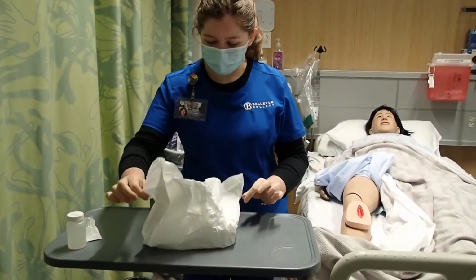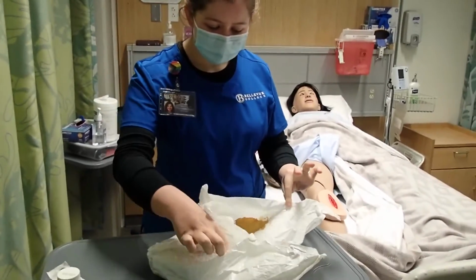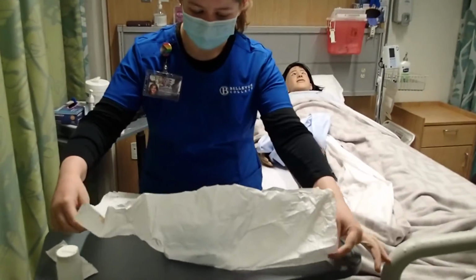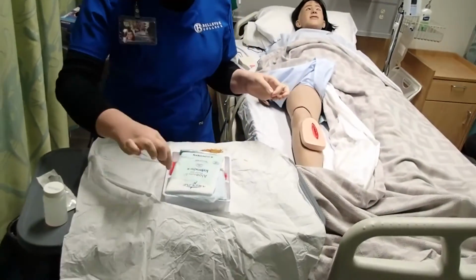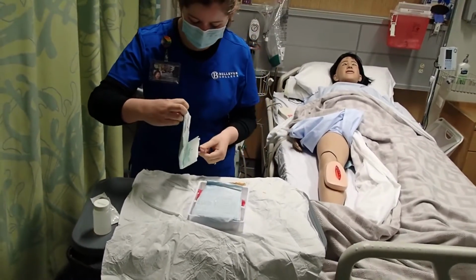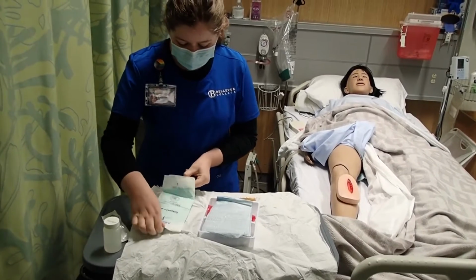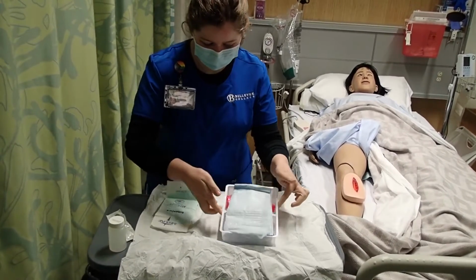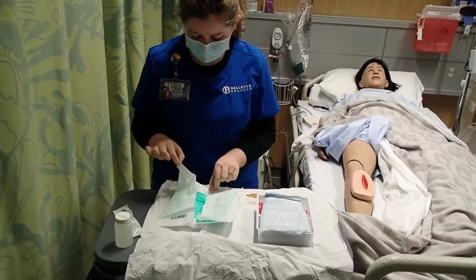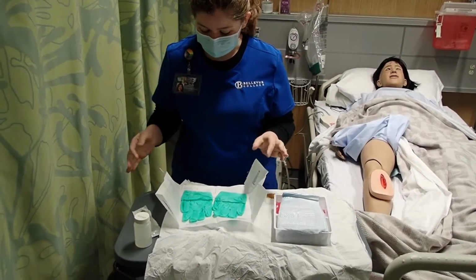I'm going to unwrap the sterile package and take my gloves while maintaining sterile field. Will apply my gloves using a sterile technique.